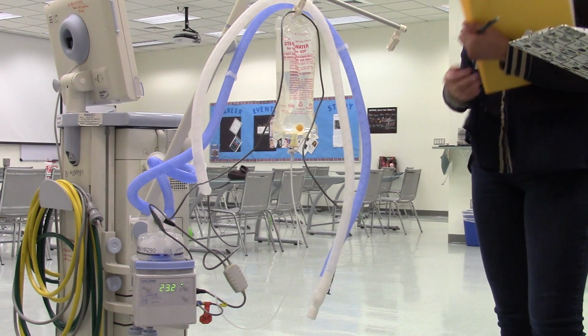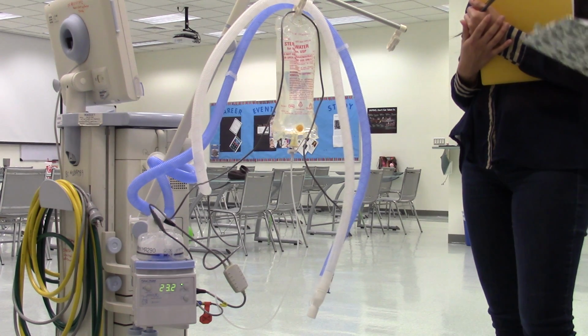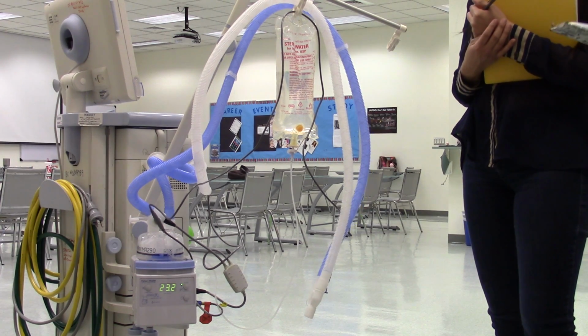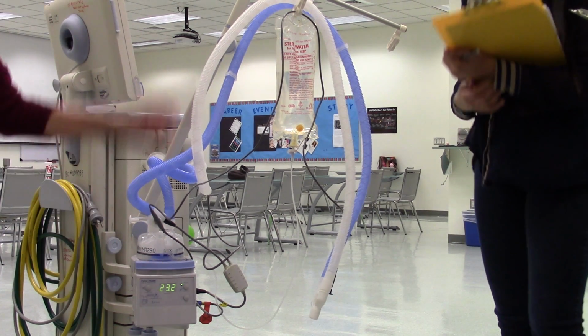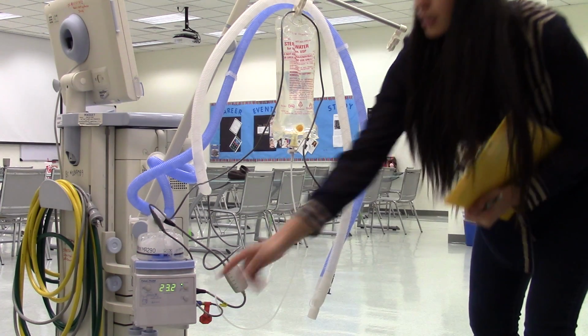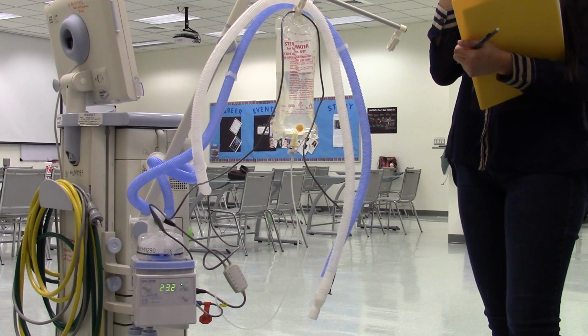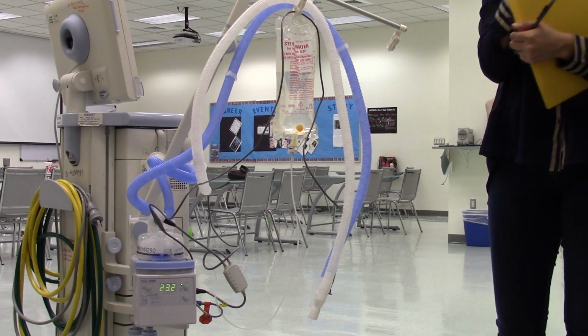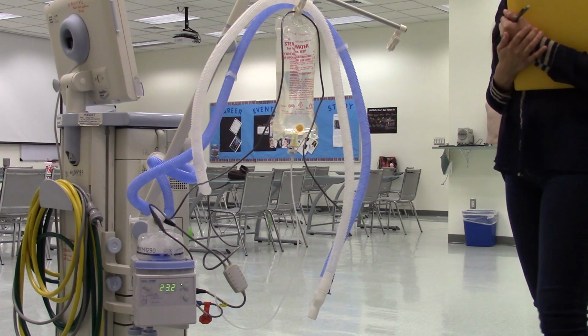What is it that it needs to be at? 37. So it'll say 39, and it'll be 37 in the patient. It would say 39 here, and then it gets to 37 at the patient. Oh, okay. Because it's body temperature.